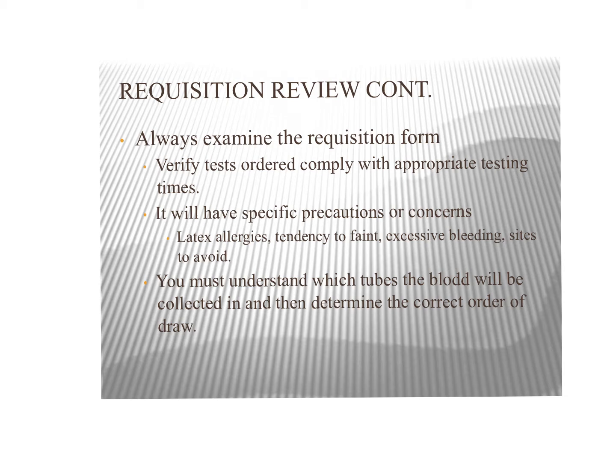If the patient tends to faint, maybe at the sight of needles or as you're inserting the needle into their vein, if they have excessive bleeding, or different sites that you may want to avoid, all of that is really important, and that should be on that requisition form, so we need to make sure we're looking at that.